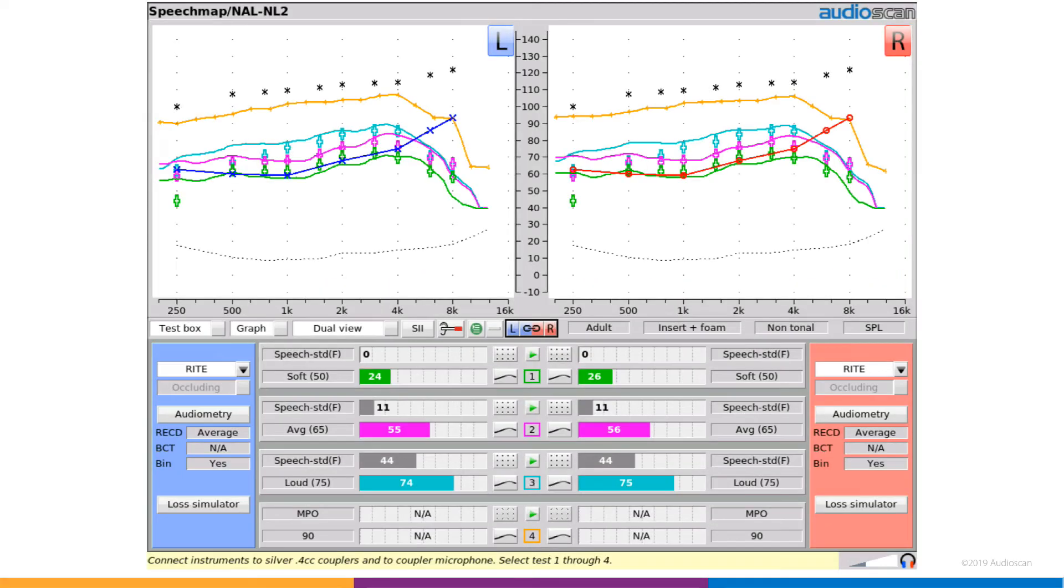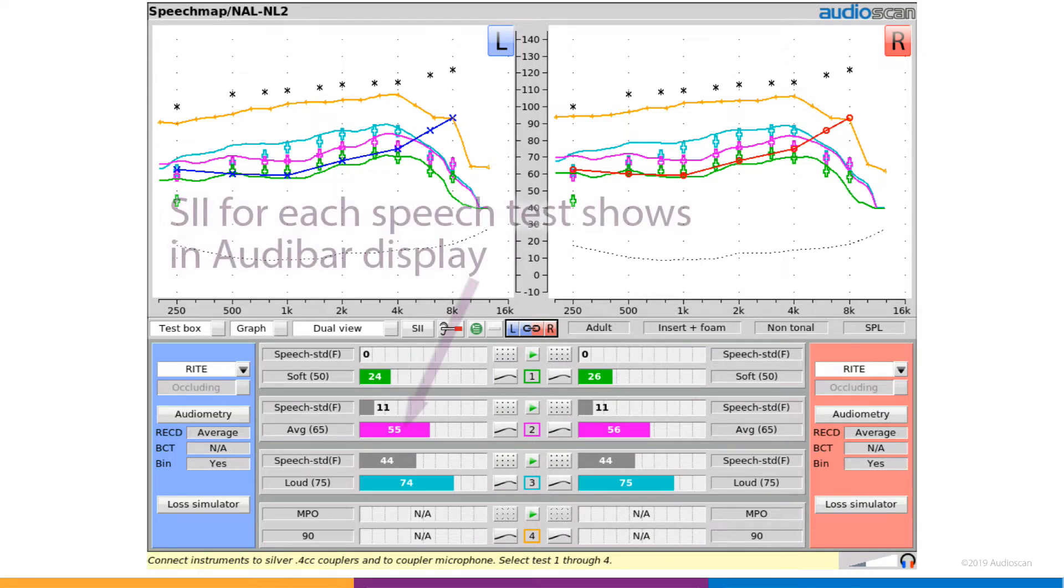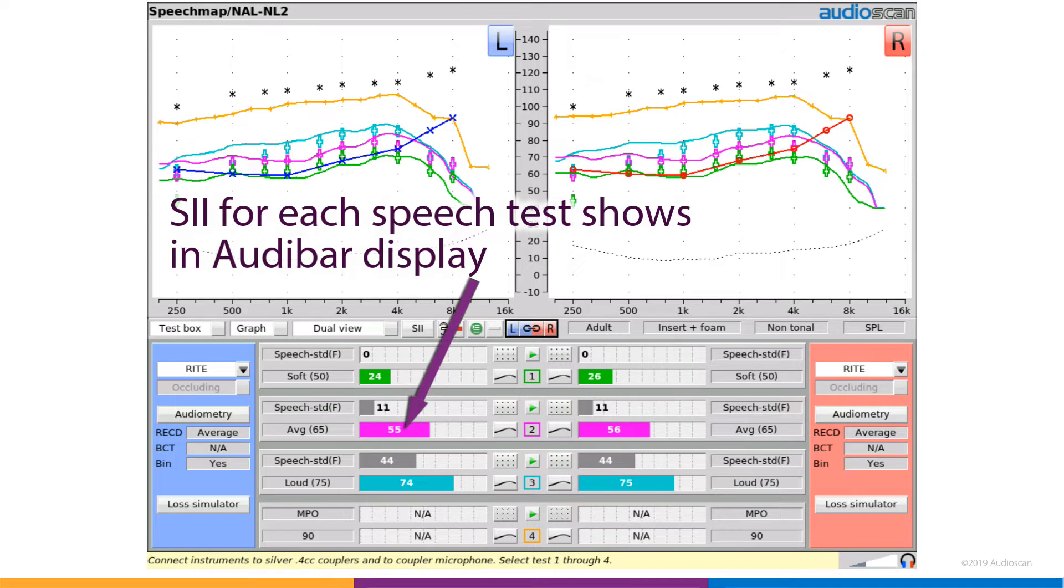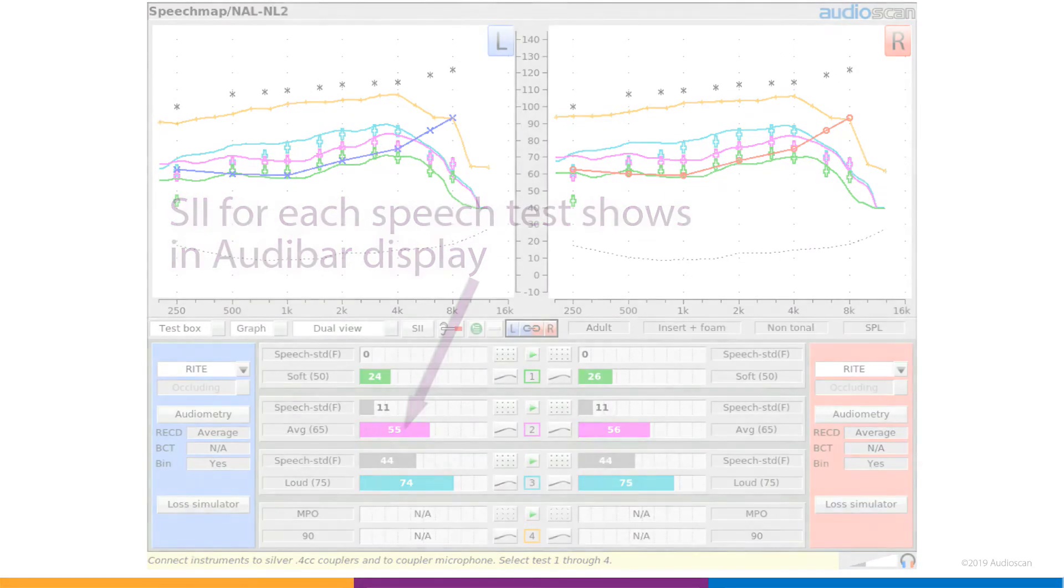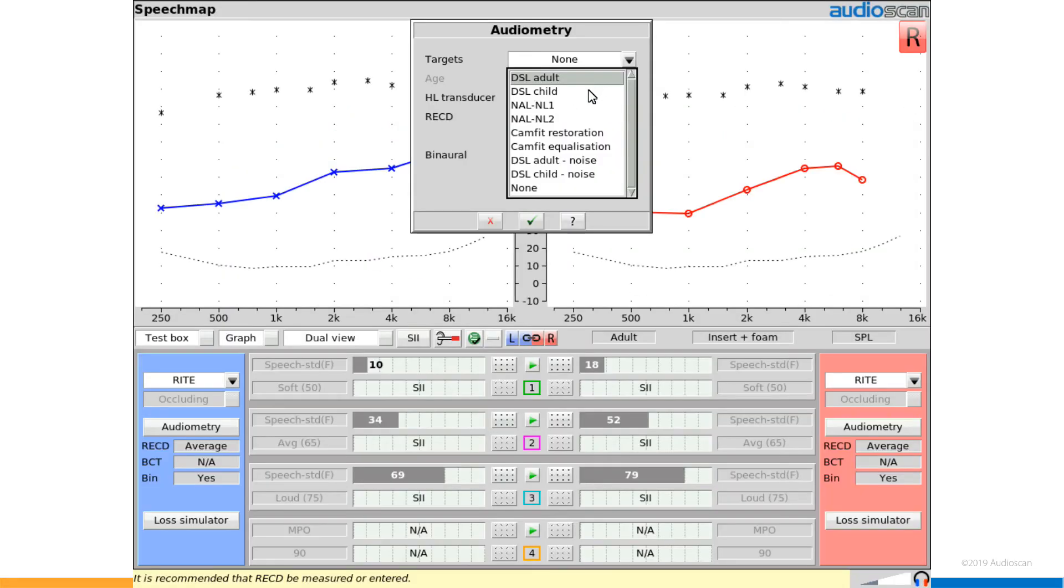SII or Speech Intelligibility Index predicts the intelligibility of speech based on how much of an amplified speech test falls within the client's residual dynamic range. The Verifit2 and Axiom include target ranges for SII when using the DSL child fitting rationale. This release extends this feature to DSL adult fittings as well, based on recently published data from Western University.